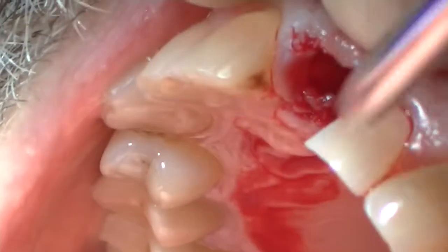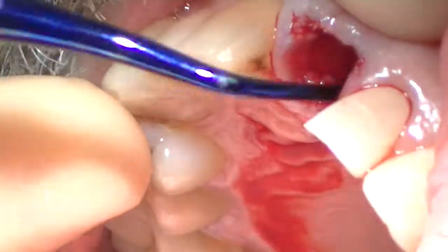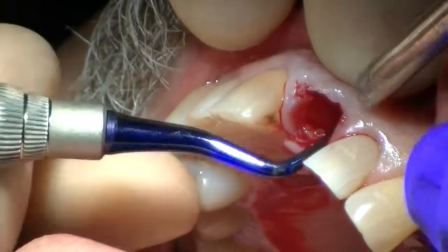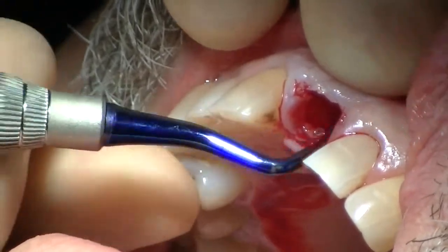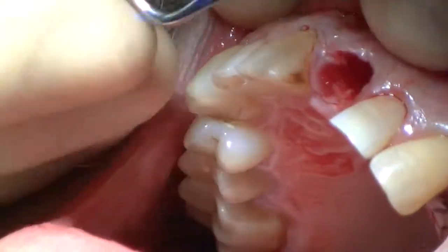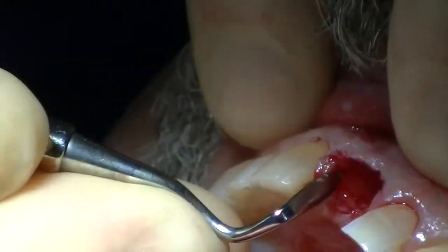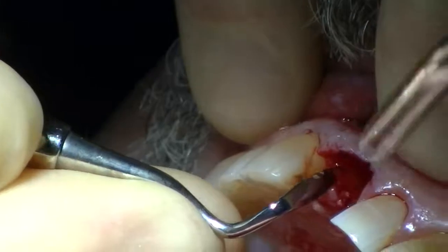So what are we going to do next? We're going to take our curette, correct? And we're going to evaluate. And I feel a facial plate. So let's go ahead and take my Orban. And remember how important that interseptal bone is.